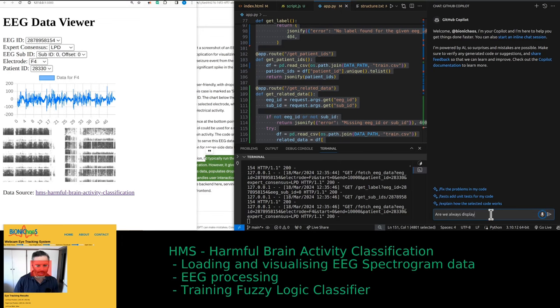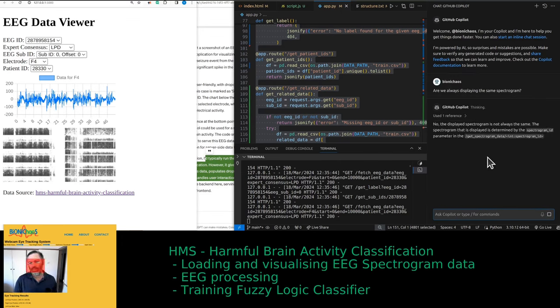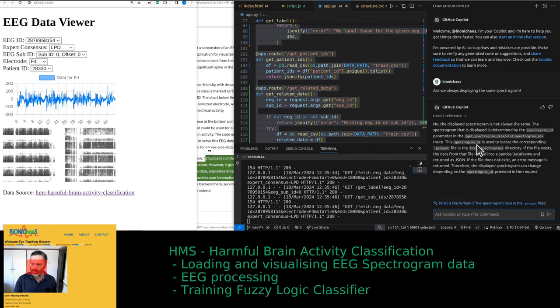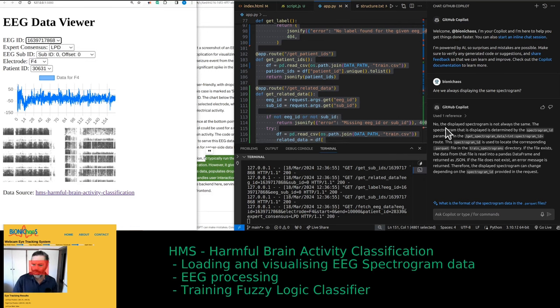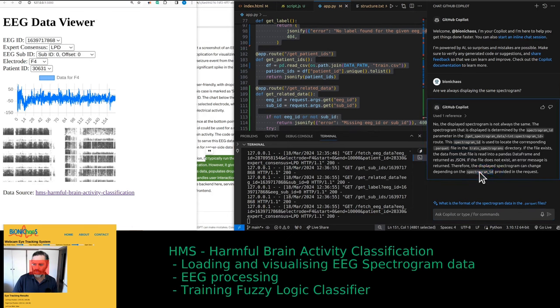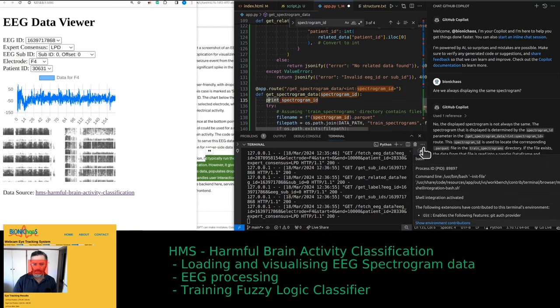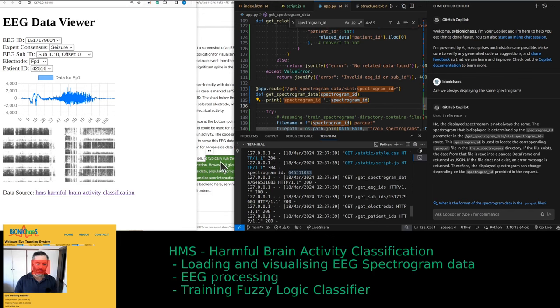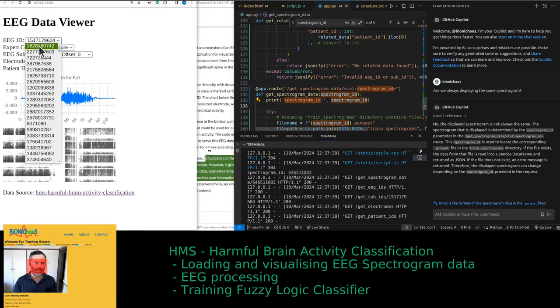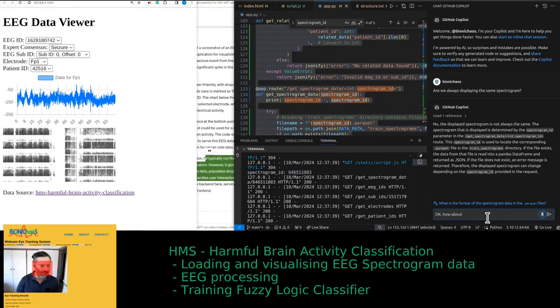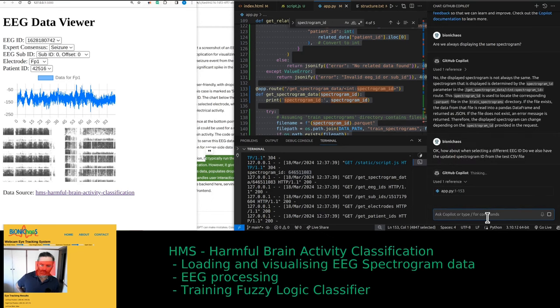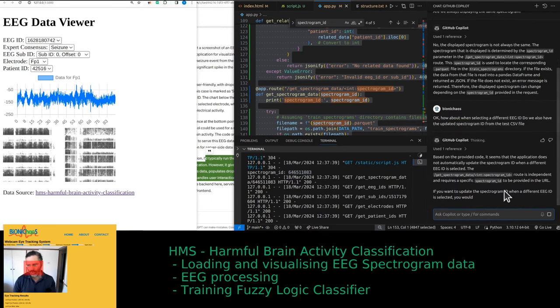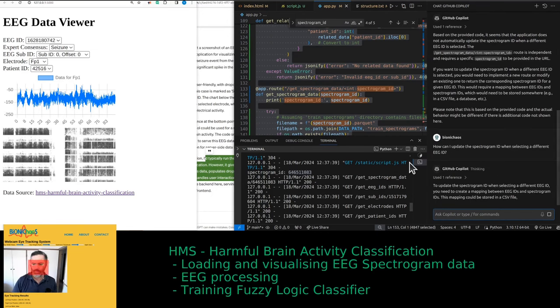Are we always displaying the same spectrogram? The answer should be yes, but it's not always the same. The spectrogram ID is used to look at a corresponding parquet file. But when we select a different EEG ID, do we also have the updated spectrogram ID? Currently it does not update automatically — we need to fix that.